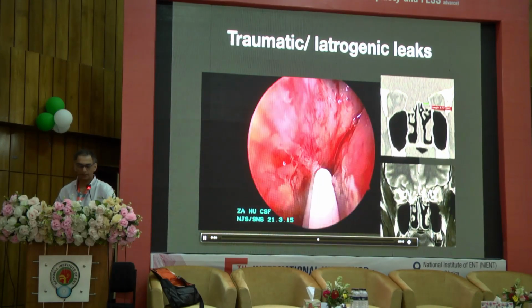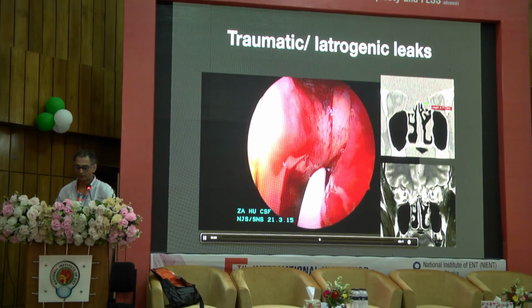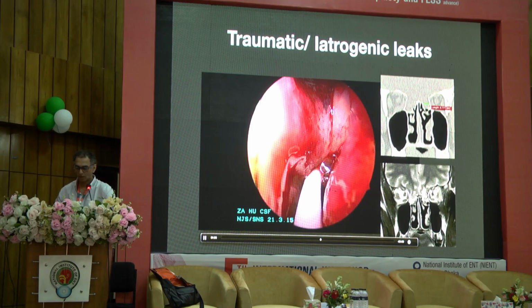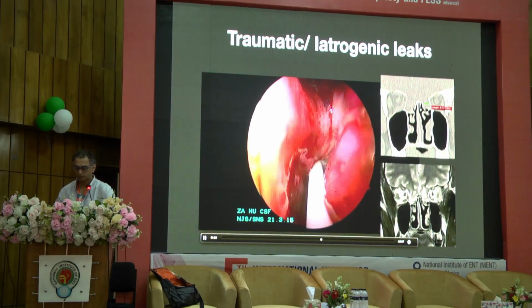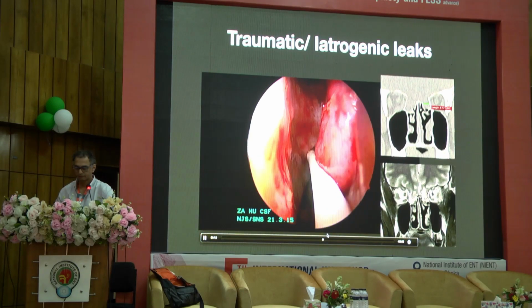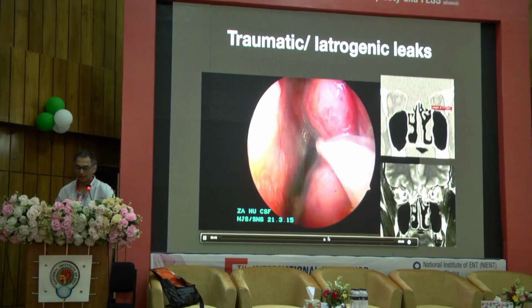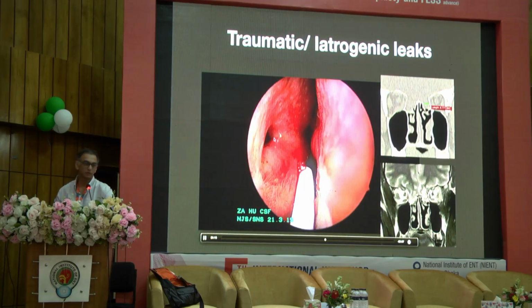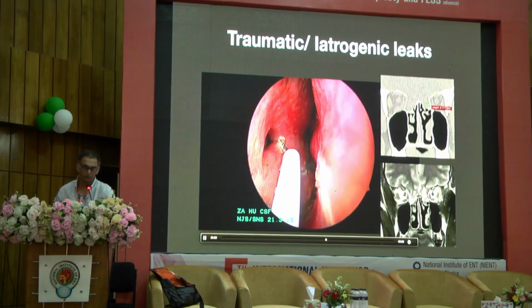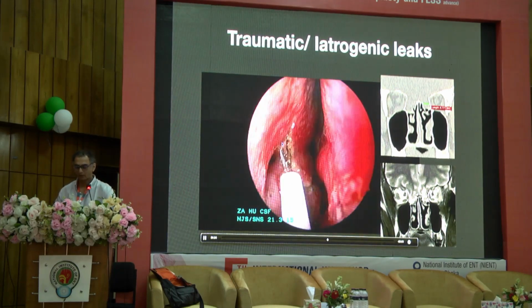So we start inferiorly with the incisions, and we come forward all the way. And I have to stop at the level of that perforation. There's no point coming anterior to the perforation, because I cannot have a flap with a hole in it. So I stop there and go up, and then I complete the incision in the upper aspect.